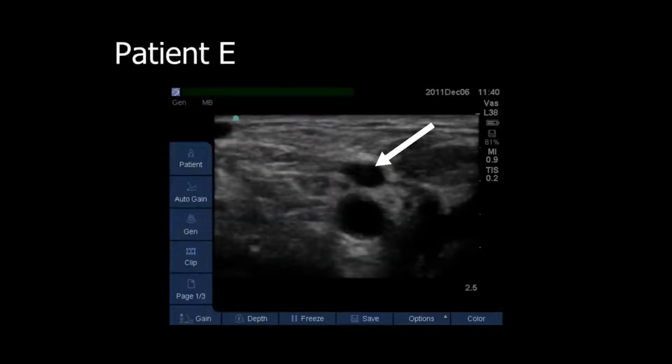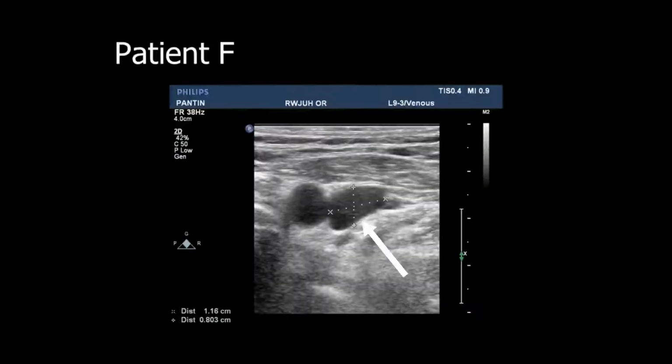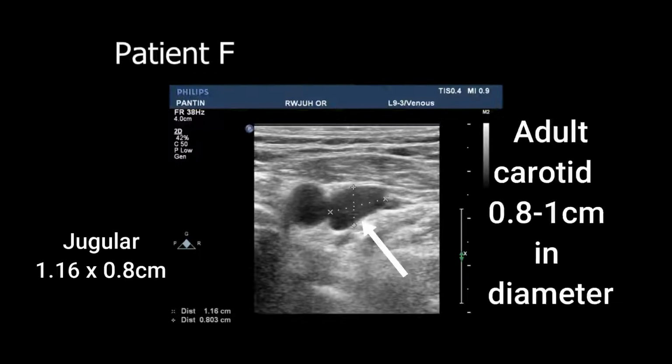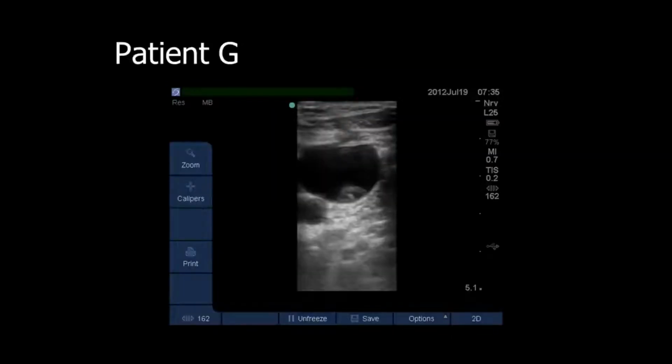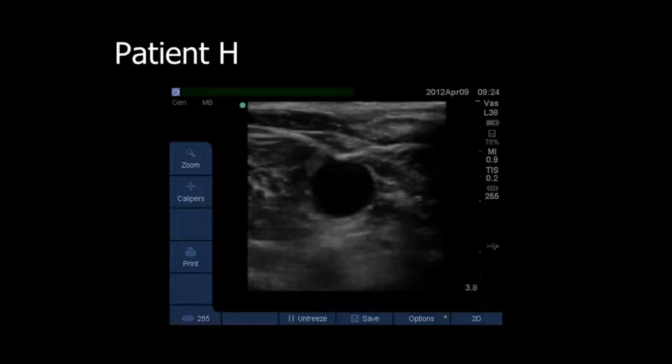Different patient with also another small vein, and the carotid in the bottom. Again, 8 to 10 millimeters of carotid. Another example of a small looking vein. But it's important, when you see it, the artery is always a good marker of size. Here a little thrombus on a different patient in the back of the vein. And this is a patient in which there is no vein actually visible. So it's important to, again, examine your neck, and then there are no surprises.